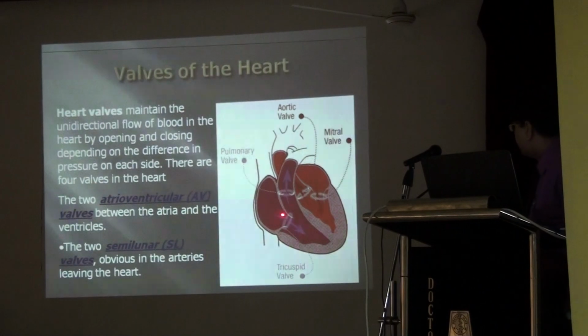So this is the mitral valve. This is your pulmonary valve. This is the mitral valve. This is the tricuspid valve. This is your pulmonary valve, and this is the aortic. All the right-sided two chambers. Importantly, the right side and left side, both sides are very important in the hemodynamics.